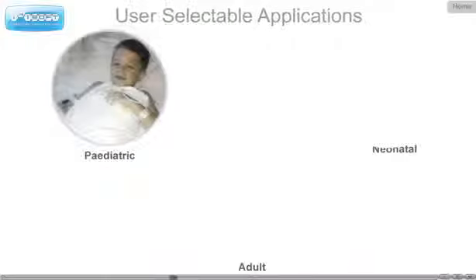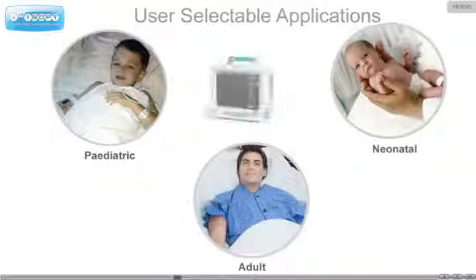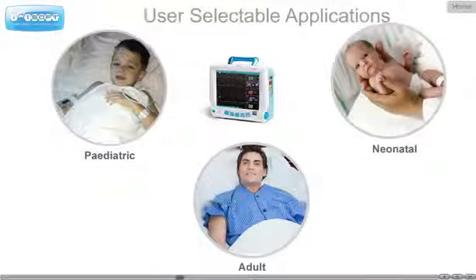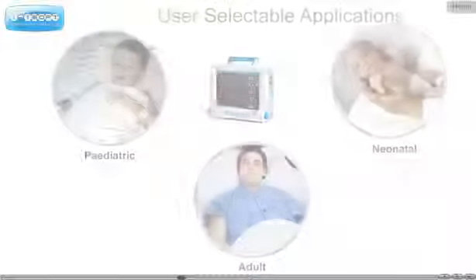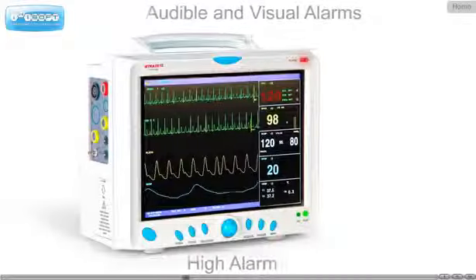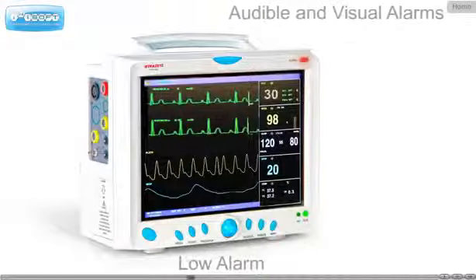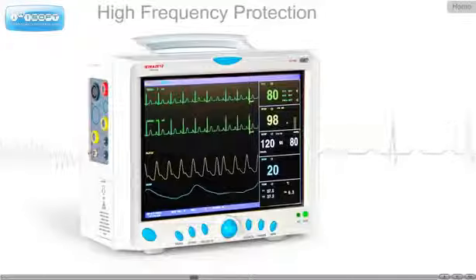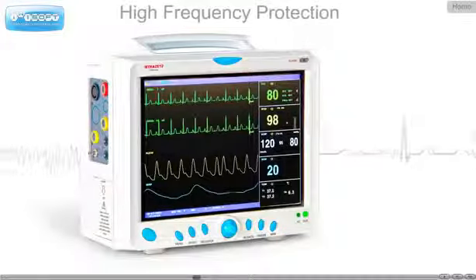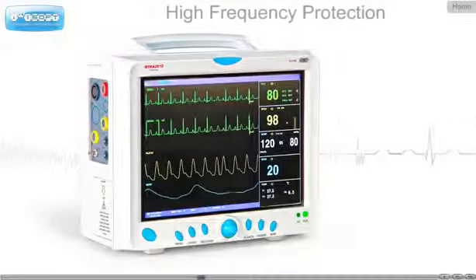Users can easily select the patient type as adult, pediatric, and neonatal. Safety alarms are generated for high and low limits for all parameters. Protection against interference from defibrillation and high-frequency waves is available.